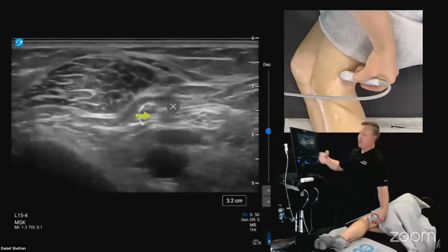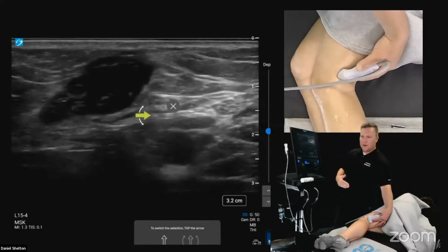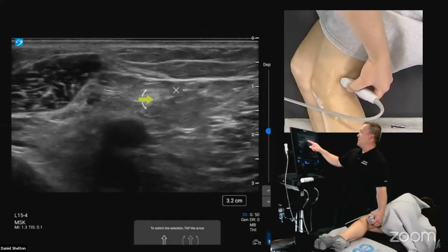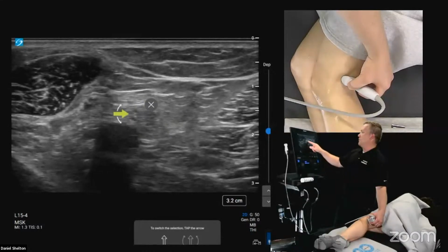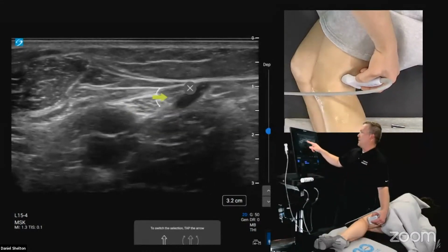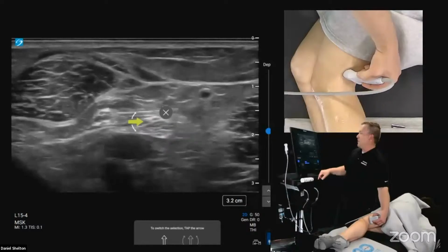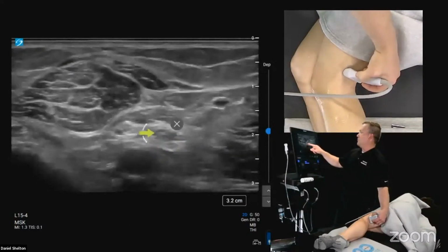So keep in mind, as you go proximal, the nerve is diving. So I have to maintain perpendicularity. So you see the very acute nature of the angle of my transducer, right? So if I were to just follow the skin and stay 90 degrees to the skin, it's very disappointing. Everything's blended in, it looks very homogeneous because nerves are a bit anisotropic or angle dependent. If you're new to ultrasound, MSK ultrasound is all about anisotropic or angle dependent tissue.